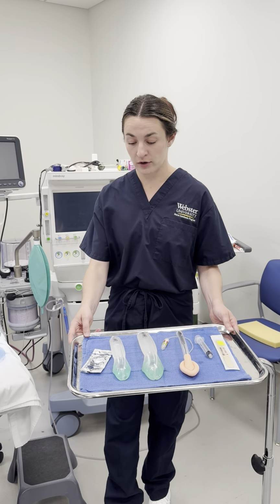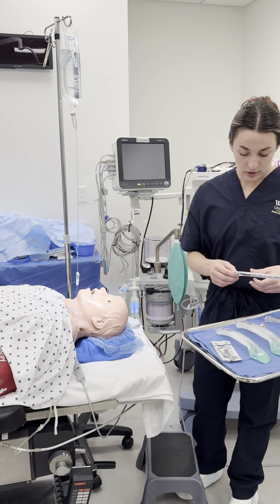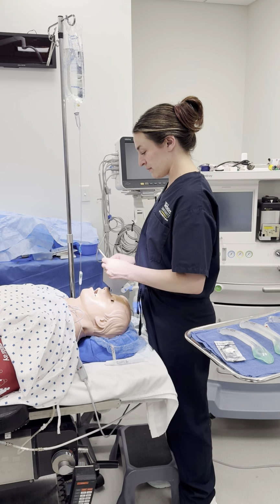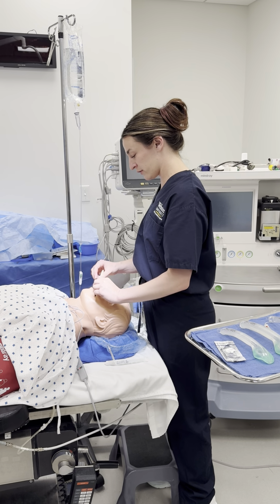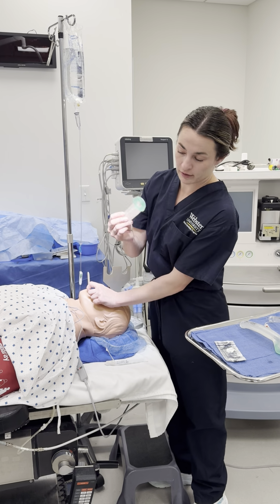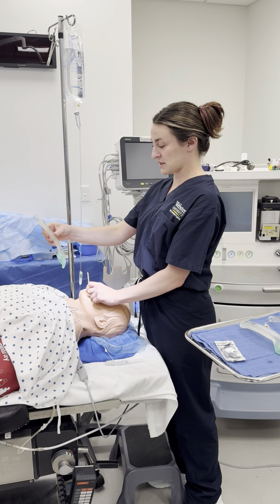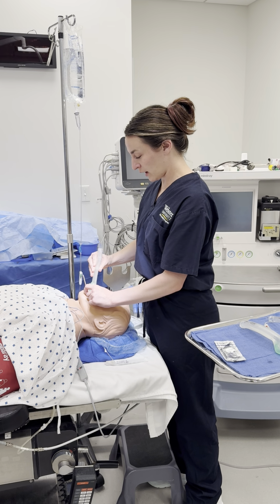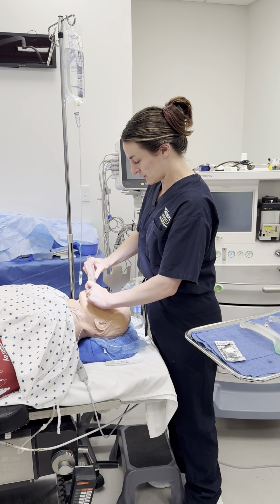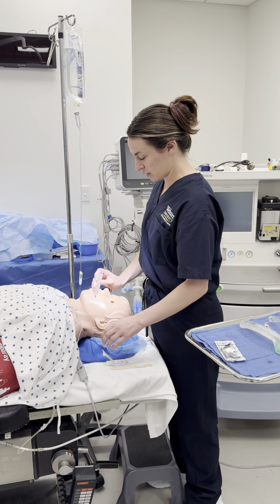So now we're going to take this over and we're going to put this LMA in our patient, all right? So first things first, we're going to want to scissor the patient's mouth open. I usually like to scissor with the tongue depressor just to make sure the tongue is out of the way, okay? So we'll scissor the mouth open. We've got our LMA already lubed and ready. We're going to take the LMA, and this side should be down. We're going to insert the LMA in here. It may take a little bit of pressure to get the LMA fully seated. And we're going to place the LMA in. At this point, I'm going to take the tongue depressor out.